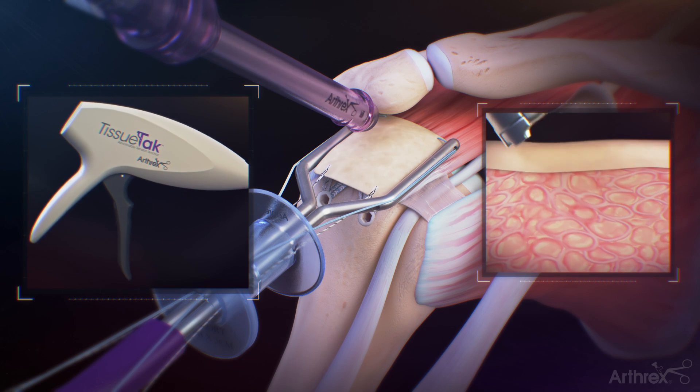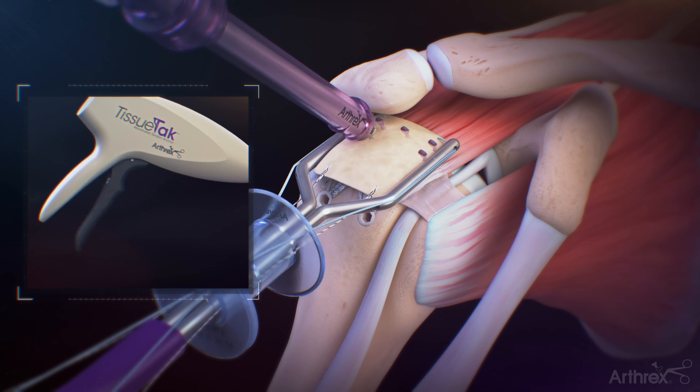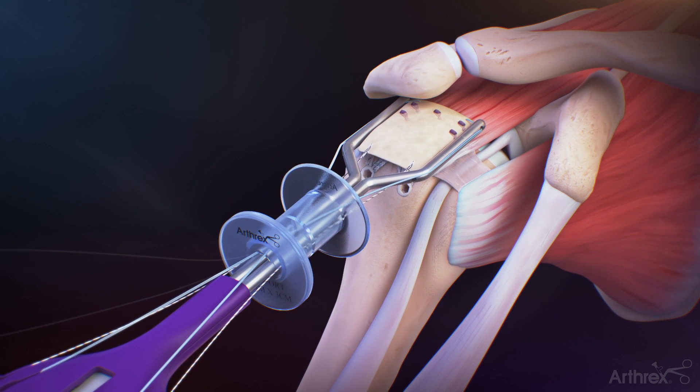Put pressure on the tissue tack inserter in order to indent the tissue with the tip of the inserter shaft prior to deployment. Working from posterior to anterior, deploy the tissue tack tendon anchors along the medial border of the ArthroFlex graft until adequate fixation is achieved.